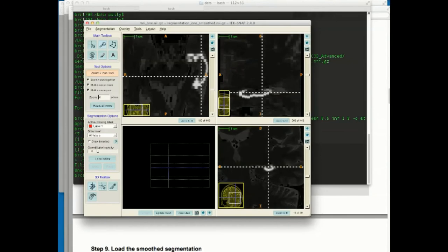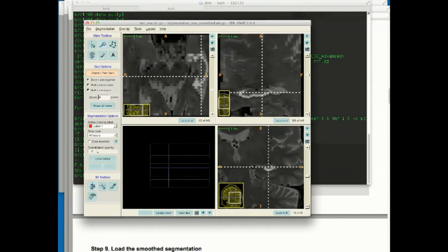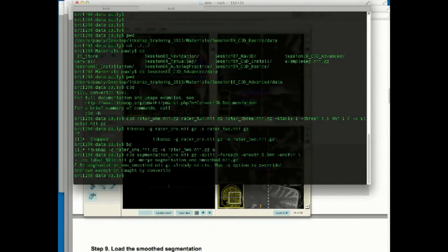That's the probability map of one of the labels. So you'll have similar ones after smoothing for all of those, and then they're going to be merged. Okay, and to bring back the segmentation. Paul talked about these shortcuts, I'm sure, in the morning, how to make them go away and how to change transparencies. Those are all useful.